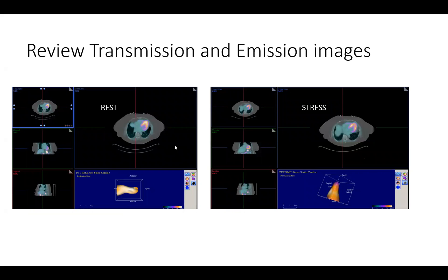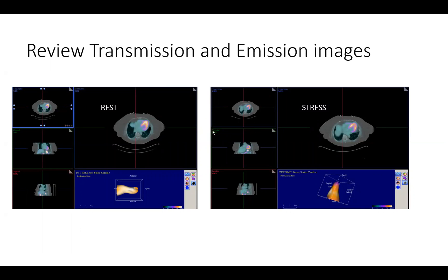Here are our familiar images for co-registration of the perfusion images and the CT images. On the left hand side we have the rest images, on the right hand side we have the stress images. With PET, all images are CT attenuation corrected, therefore you should look at both and make sure that registration is accurate in both instances, so you don't generate artifactual defects that can be misconstrued as perfusion defects.